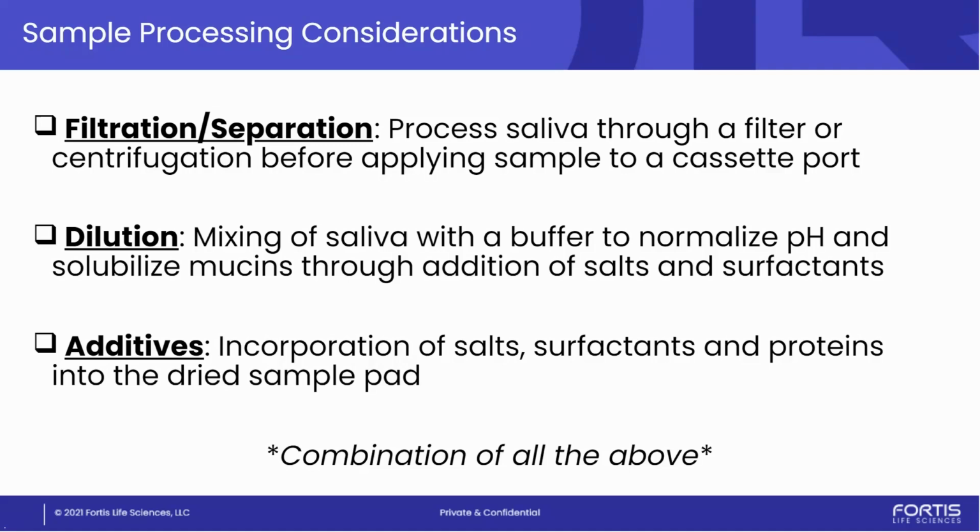Now, for quantitative tests, for example, in saliva, passive drool is going to be very difficult. It's going to be very difficult because of that variability. Depending on your test platform and your system, you want that filtration to occur as early as possible, or have a level of filtration occurring all the way at the sample collection portion. That can be done really through the swab itself, or if you do have passive drool, you can push it through a filter on the device itself, or a different metric, but you do need to somehow extract and separate that liquid phase from the mucin. And the mucin is really the major problem.